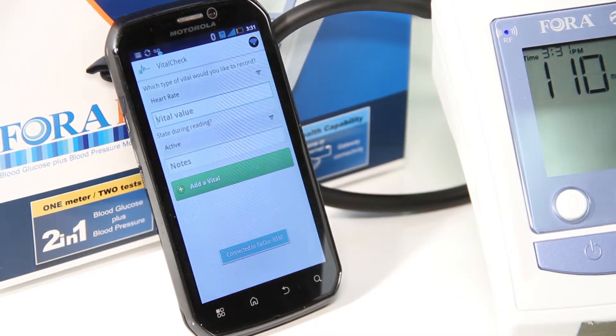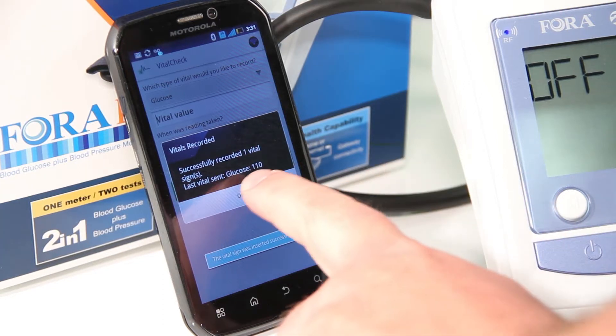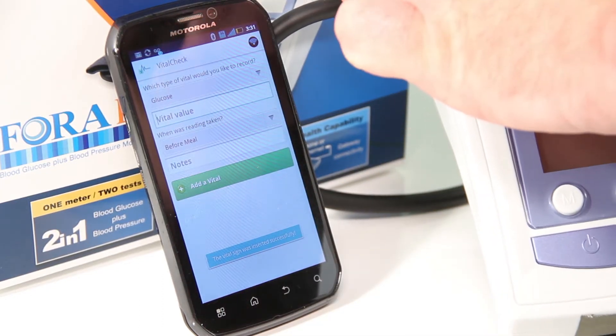A started Bluetooth service message should appear at the bottom. Any past vital signs taken by your device will upload to My Virtual Health Check upon connection. Once a vital sign has been successfully uploaded, tap OK on the confirmation screen.